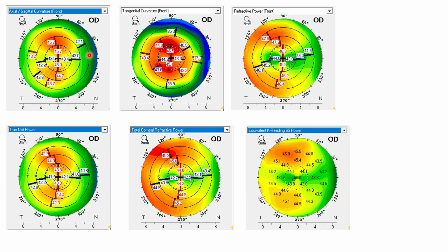Sir, I'm not sure about the new Swept-source OCT technology versus Scheimpflug imaging values, sir. It'll be interesting because apparently the resolution of the OCT is way ahead of Scheimpflug. And apparently the corneal powers derived from OCT might be way superior to Scheimpflug, which we are currently using. So it remains to be seen whether that will eventually take the lead.